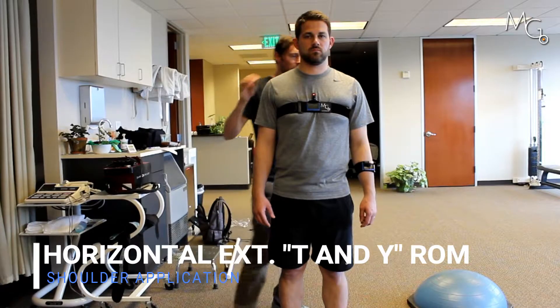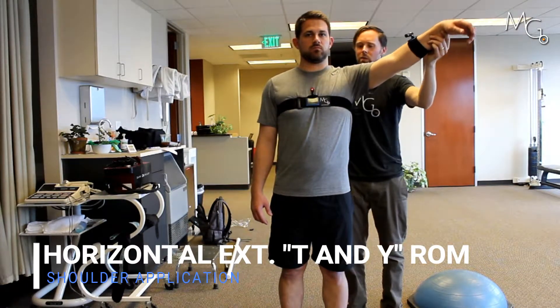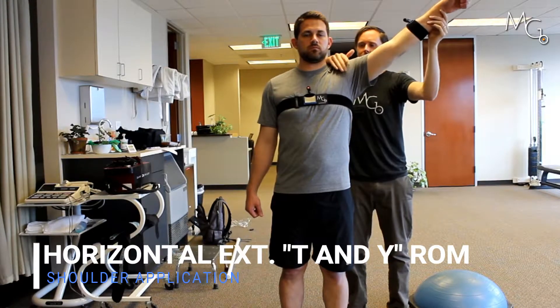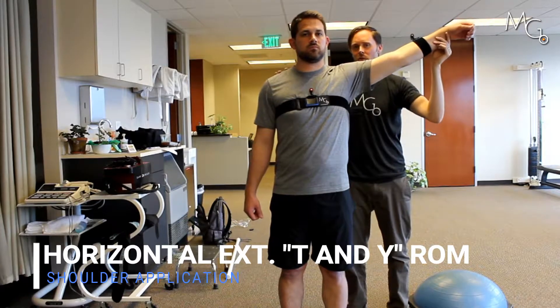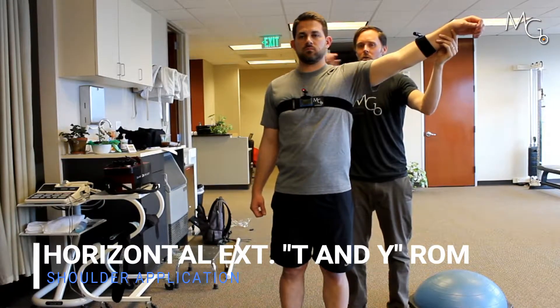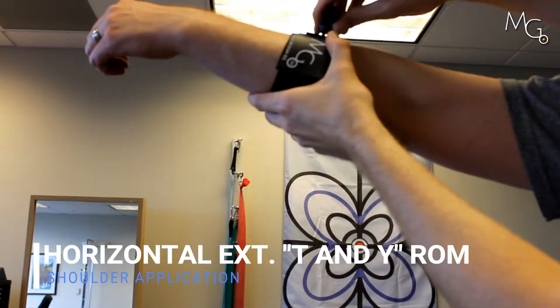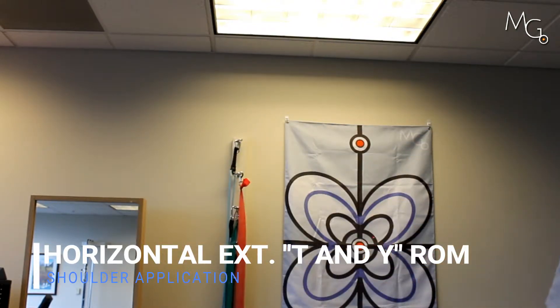Then we're going to bring the arm to where we want it. So let's say we're doing that kind of Y abduction position — trying to get a pure amount of extension here without Chris rotating his thorax to get the motion. I'm going to bring this out to here, turn on the second laser, center that up as well, and then come back down.